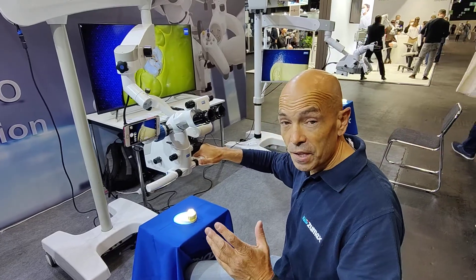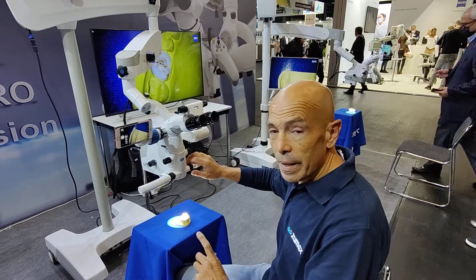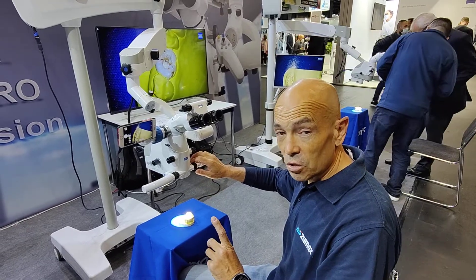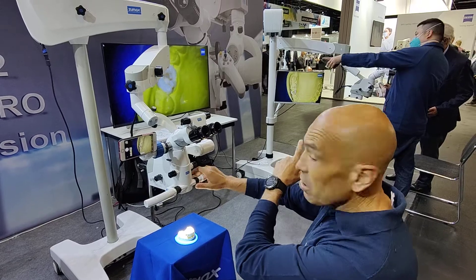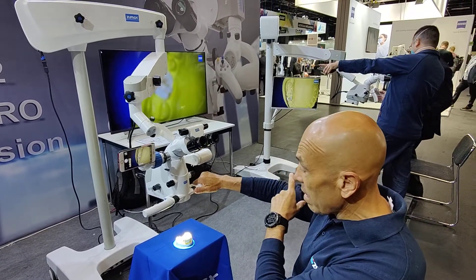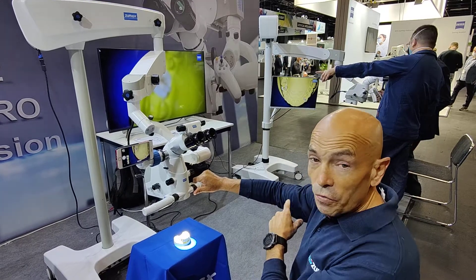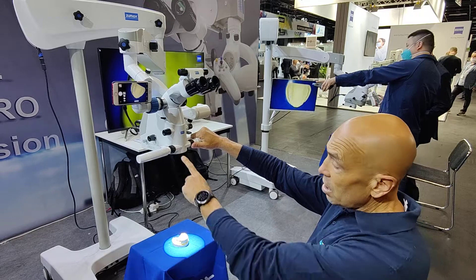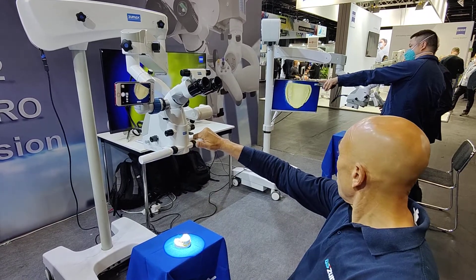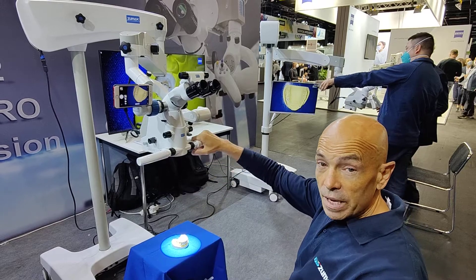Another very good feature is the focus. We have the focus with the zoom, which is 25 cm. If you look at the video there, you can see that the video is very small, we are very close, and we are on focus. So if we go high like this and we just turn the focus, we're going to be on focus and you can see how much range of value we have.